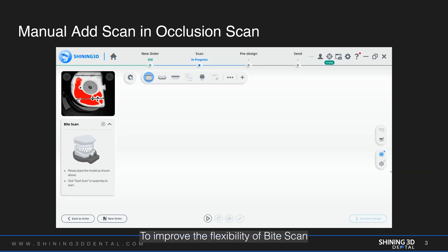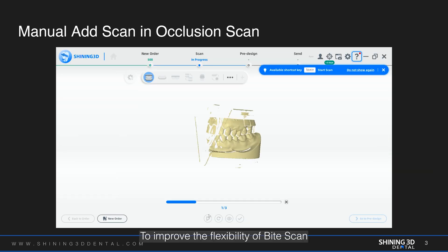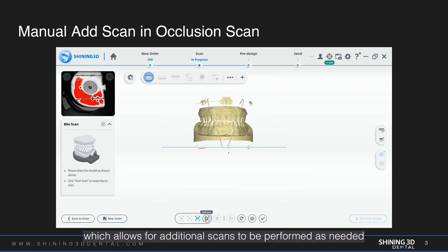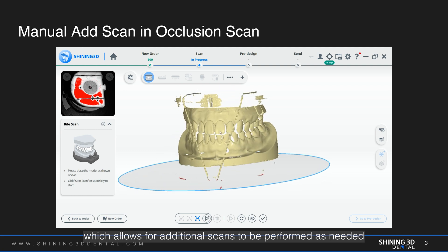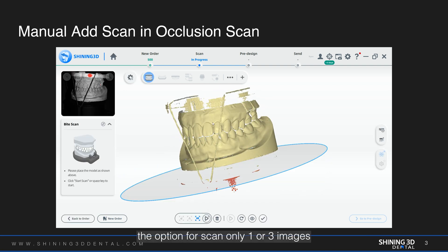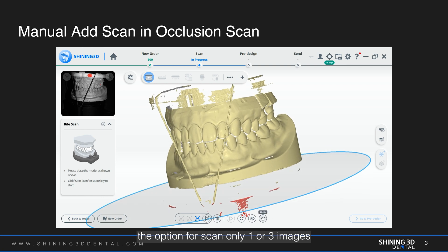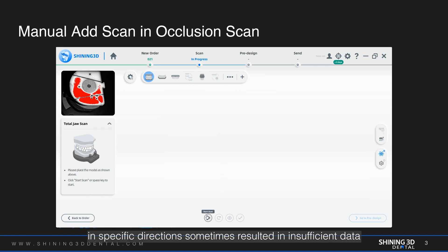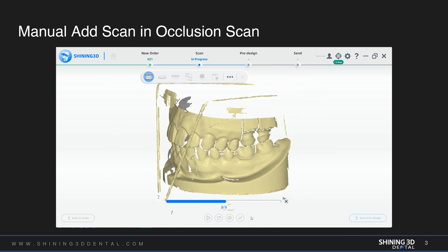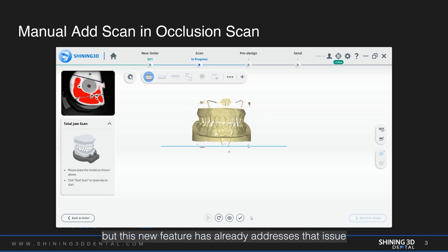To improve the flexibility of bite scan, we have introduced an add scan option, which allows for additional scans to be performed as needed. Previously, the option to scan only one or three images in specific directions sometimes resulted in insufficient data, but this new feature has already addressed that issue.